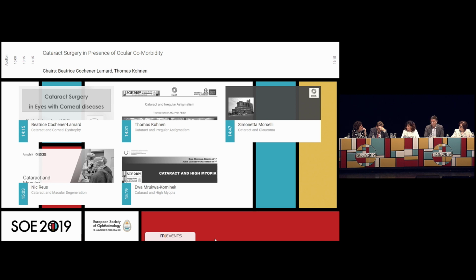What I do think is that the phakic cataractous lens blocks so much light that even if you put in a yellow lens or a clear lens, the difference is amazing. I think that's important for your daylight levels. Any lens you put in is for the better. I also think it's good for these patients who have had cataract surgery to go outside again and walk in daylight, because that's the best source for blue light. They can spend time outside with their grandchildren, who also have to spend 2 hours a day outside, and they won't have any sleeping problems maybe. So it's a good transition with myopia.